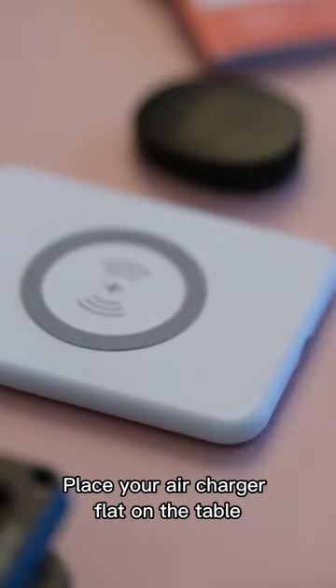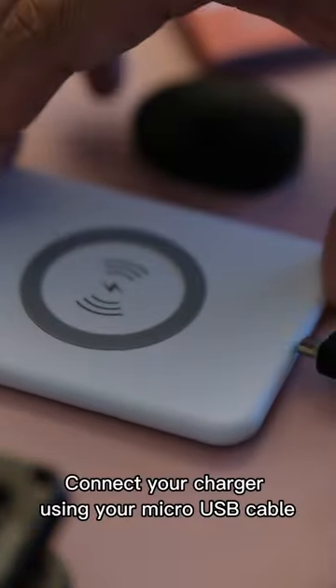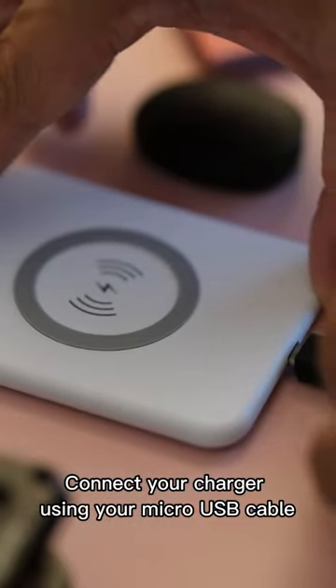Place your air charger flat on the table. Connect your charger using your micro-USB cable.